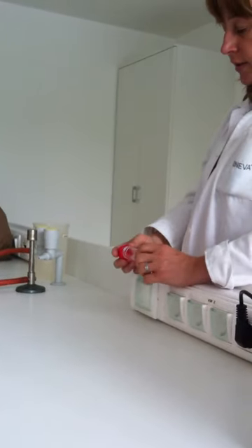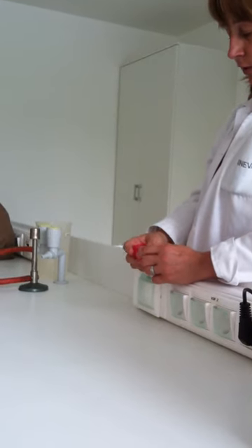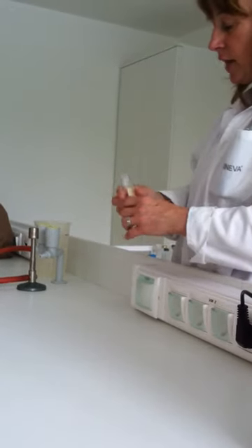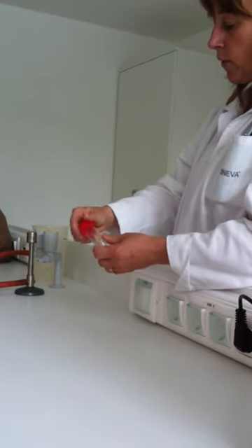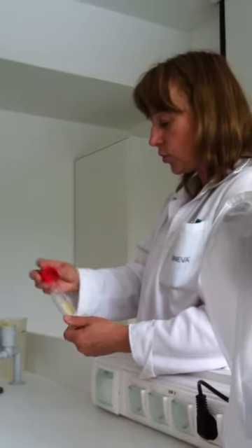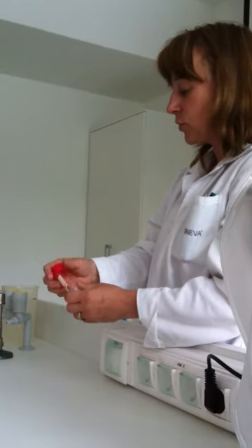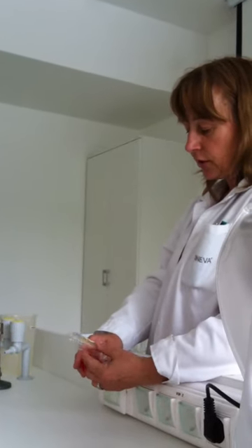Try to decrease the contamination with normal flora, but it's of course impossible. And from the deepest part, as deep as possible, the patient should cough, and then you should collect in the sterile tube. Very important that you close it very carefully, because if it is not totally closed, then you can find contamination on the outside surface of the container, not good.